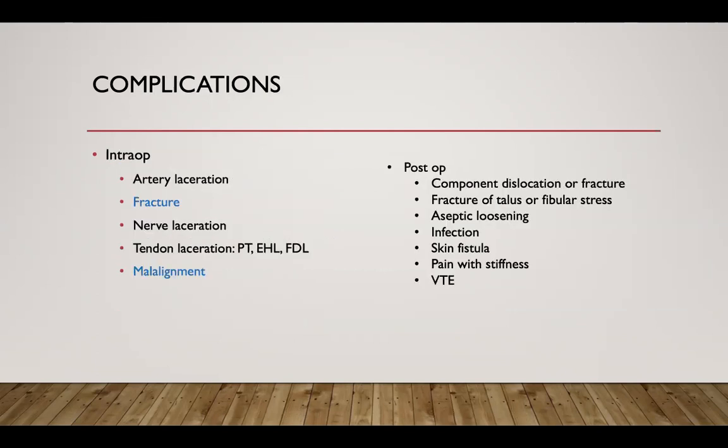Complications, intra-op, you could have a fracture when inserting this. You can get malalignment. Post-op, it's the normal things you think about after you do surgery or fixation: infection, pain, thrombosis, and that's it.